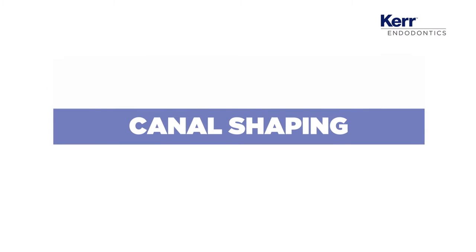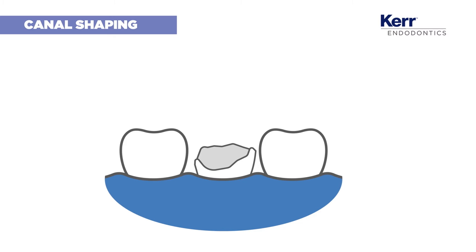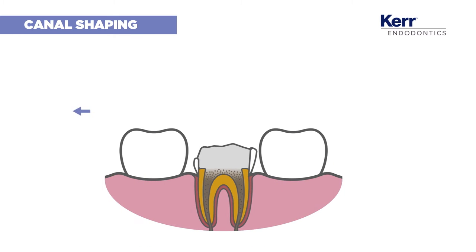We are approaching one of the more challenging phases: canal shaping. No two root canals are the same, so using an efficient file is fundamental.